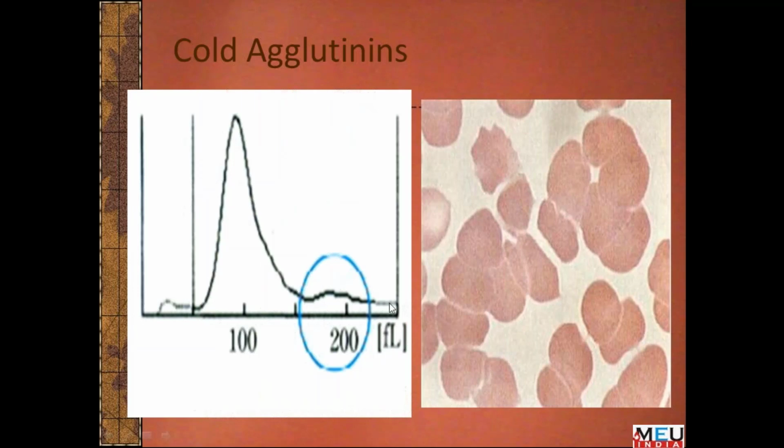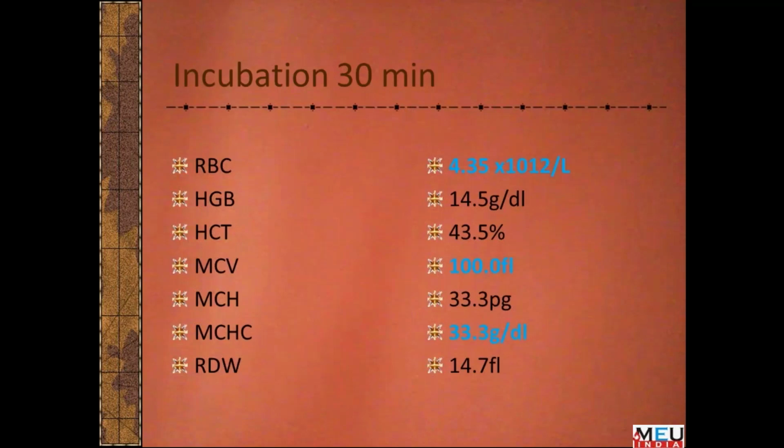Quite often we are called in the middle of the night from blood banks, and these cold agglutinins, especially in North India, are a big culprit for calls in the middle of the night. The technician says that for almost all the cells, the blood group cannot be found out. It even comes positive with A, B, AB, everyone, and a slight heating of the slide solves the problem. We just incubate the slide for 30 minutes and the RBC count comes to normal.